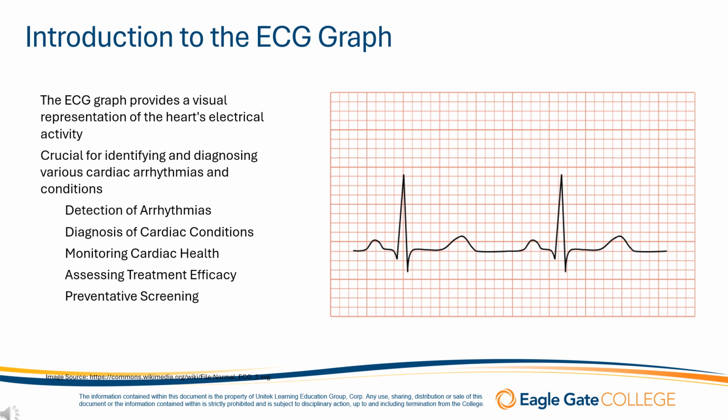For patients with known cardiac issues, the ECG graph is used to monitor their heart health over time. This is particularly important for patients who have undergone procedures such as pacemaker implantation or those on medications that affect heart function. Regular ECG monitoring helps in adjusting treatments and ensuring that the heart is functioning optimally.